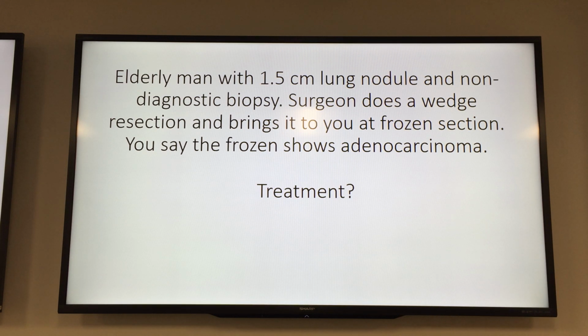We used to ink it, but it makes no sense, because the pleura floats. It's in the chest cavity and not connected to anything, so that's not a margin. All right, this is a great discussion because it makes things clearer in terms of resections to everybody.